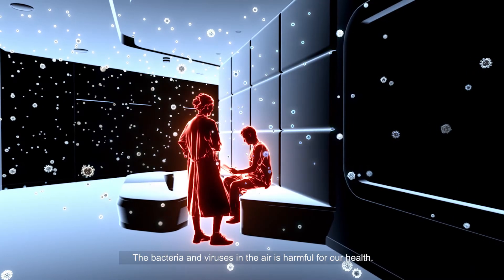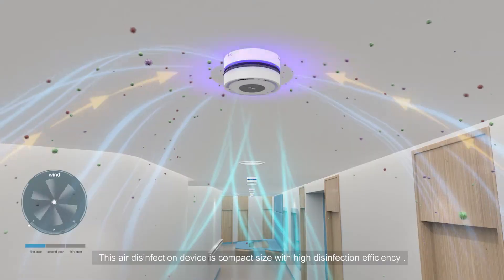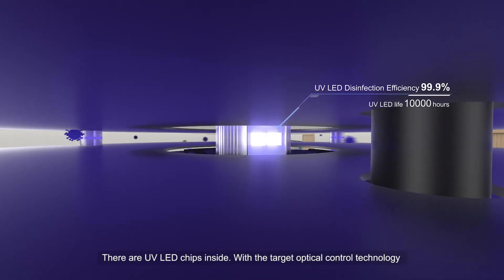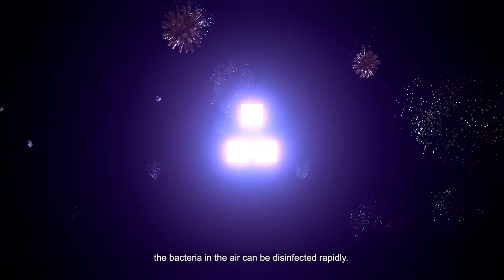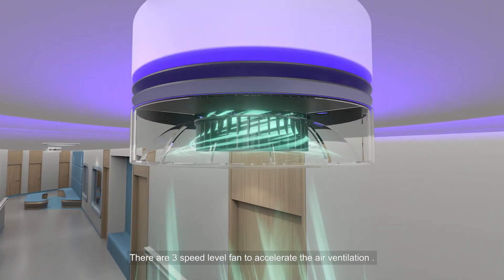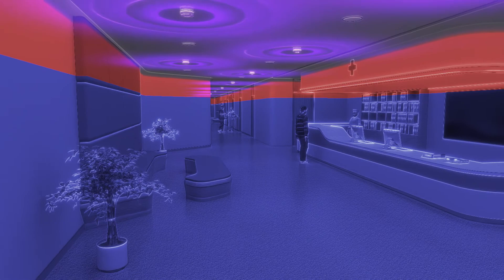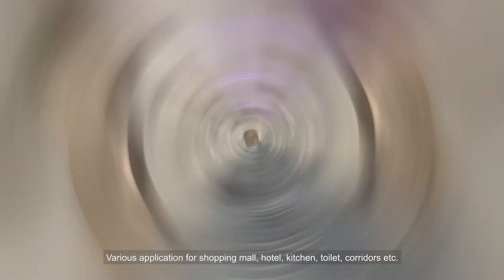Bacteria and viruses in the air are harmful to our health. This air disinfection device is compact with high disinfection efficiency — the first mini UV upper-air device in the world. UV LED chips with targeted optical control technology disinfect bacteria rapidly. Three fan speed levels accelerate air ventilation. Two installation methods are available: surface mount and recessed mode. Applications include shopping malls, hotels, kitchens, toilets, and corridors.